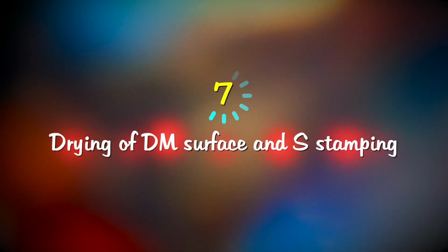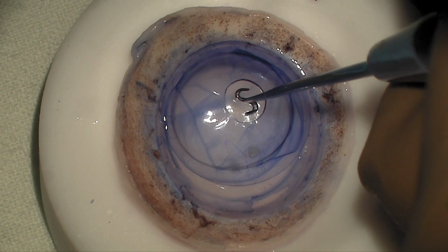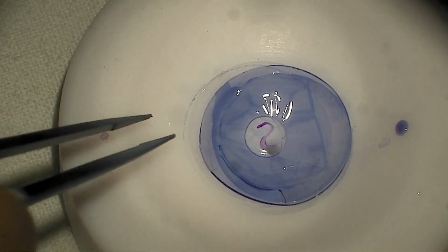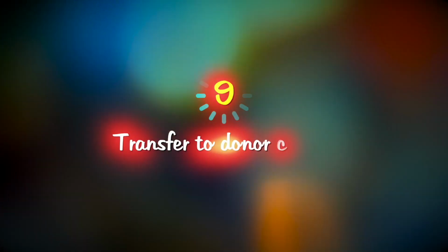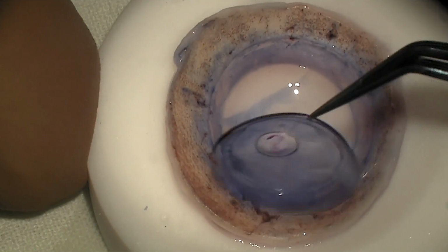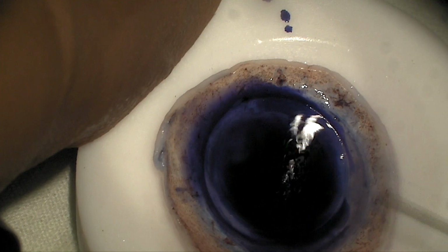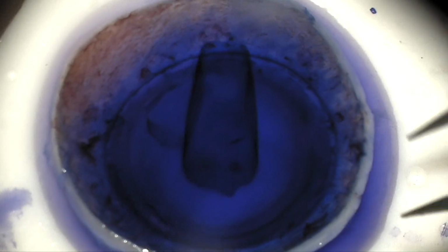Soak the interface fluid. Flip the BCL supported tissue, dry the DM surface and give the S stamp. Final 8 mm trephination, which is then transferred to the anterior stromal donor tissue cup. And then finally staining with trypan blue and transferring it to a petri dish.